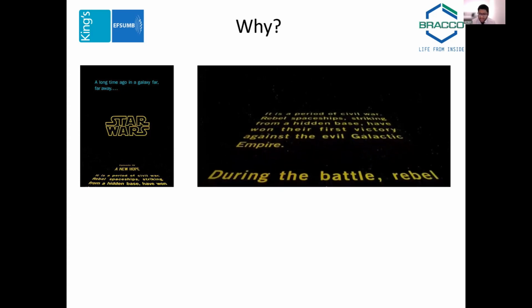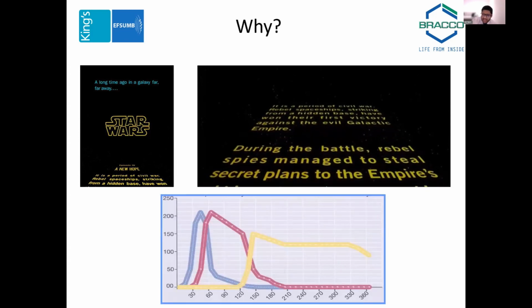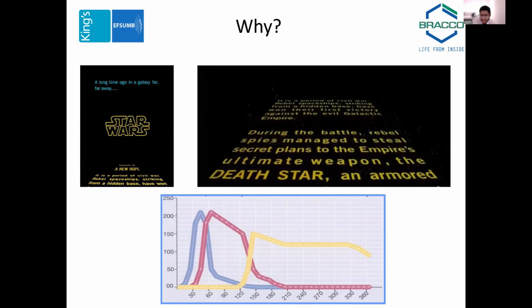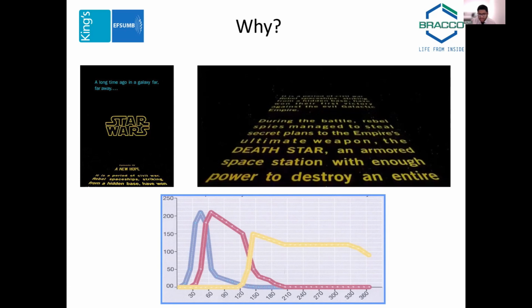You can predict it because the phases that we talk about in the liver, they are in fact overlapping. They're not discrete entities. You have an arterial phase, a portal venous phase, and a late phase, but it all exists over a spectrum. There's not an abrupt start and finish.